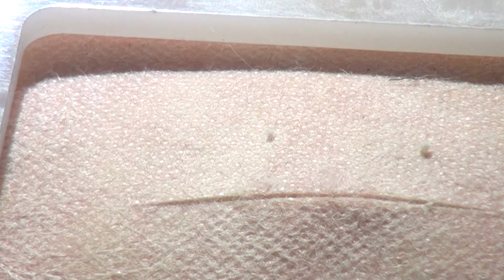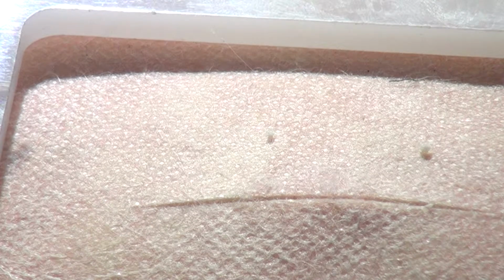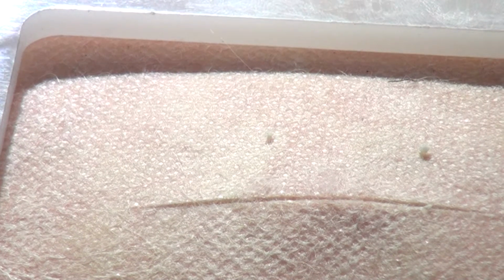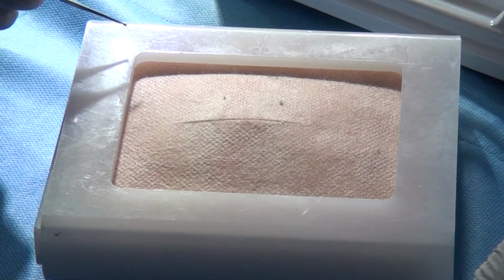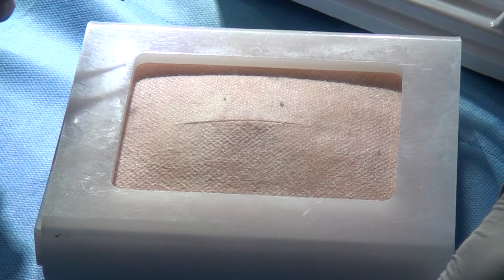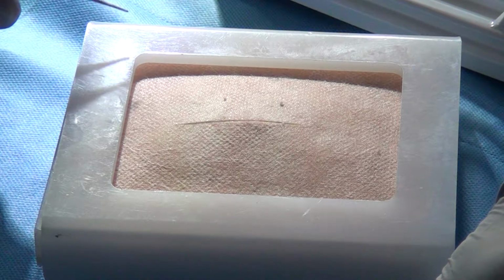Good. I didn't want to simply tell you what is obvious. Blade is better than scissors when it comes to cutting, because any instrument which has two blades will first crush and then cut. Crushing leads to death of tissue, which is a very important cause of post-operative wound infection. Therefore, blade is superior to scissors when it comes to cutting and raising a flap.